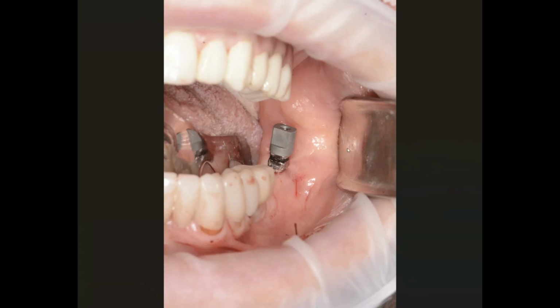Why? Because when you try to use an intraoral scanner and scan number 17 and you try to scan number 32, you're not going to have a line. They're not going to align. They're not going to align every time. Sometimes they're going to align close. Sometimes they're going to align very far off. And it was no surprise to me on that very first surgery, 5 or 6 years ago, that the lab tech that worked in my building, right across in the back, came to me in the surgery room and said, "Hey doc, I can only align the right or the left. Which one do you want me to align to?"